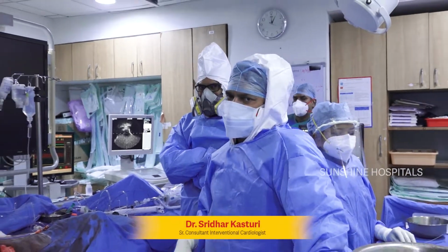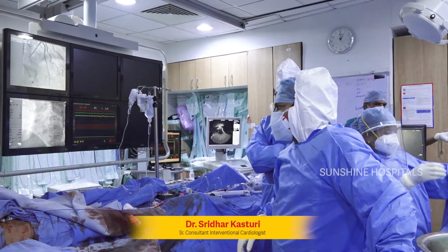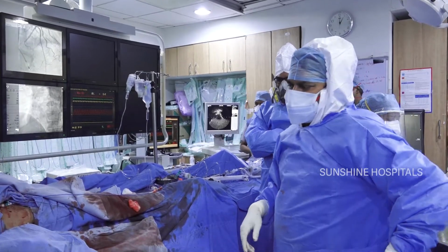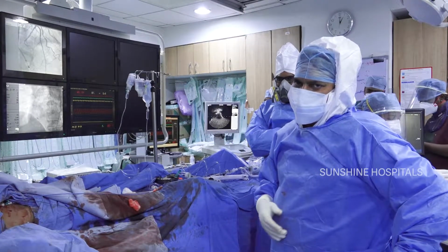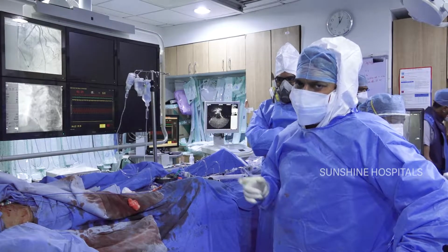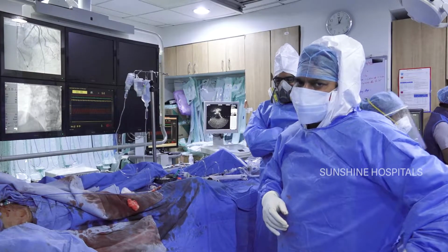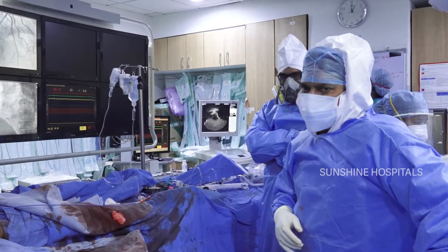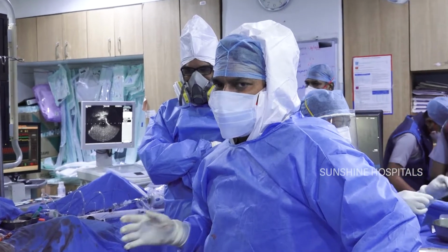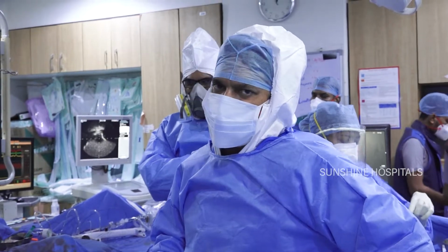Today we are showing a very severely calcified vessel PCI, and this patient had unstable angina, classical episodes of chest pain, and severe triple vessel disease: right coronary non-dominant CTO, left circumflex bifurcation lesion, LAD diffuse long segment lesion involving proximal to mid, distally also diffuse but it's a well patent vessel. But proximal to mid there is severe calcification, at the mid LAD level the patient had a very tough calcium.